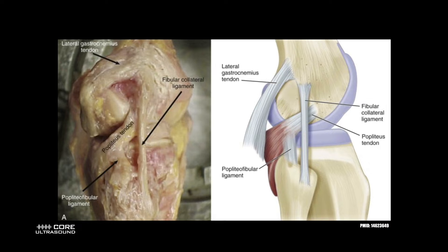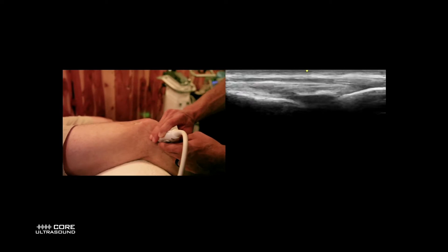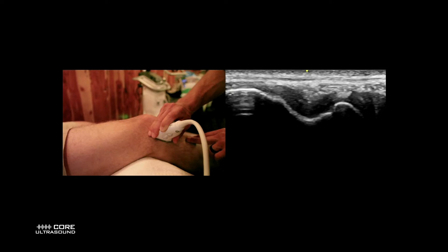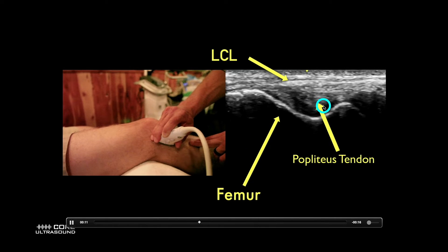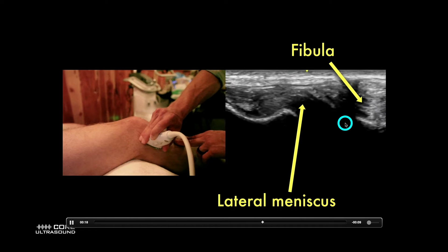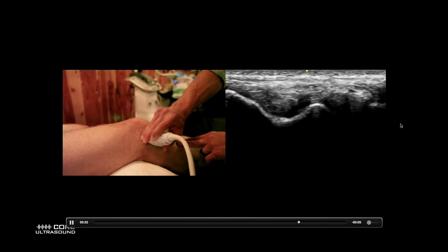On the lateral side, there is one other structure we need to be aware of, and that is the popliteus tendon, which can be confused with a meniscus or with an LCL. Placing the transducer on the lateral aspect, we see a groove, and we can see the popliteus tendon in that groove with the LCL right on top of it. Deep to that, we are going to see the lateral meniscus and then the fibula inferior to that.